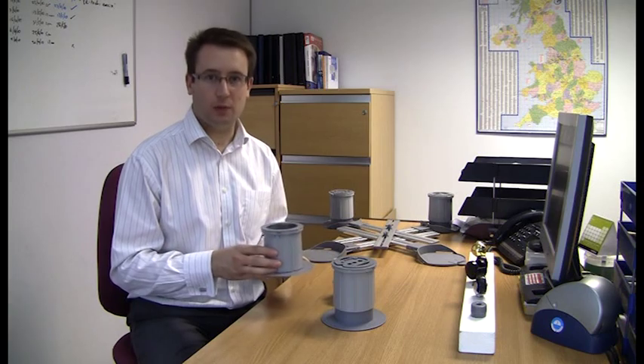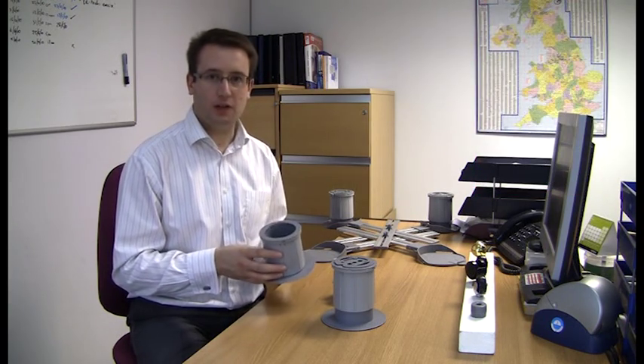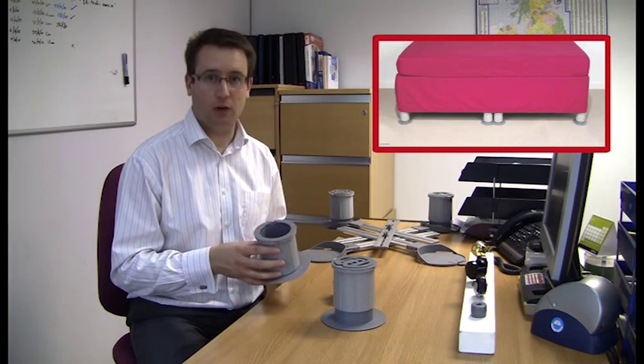The Medici Furniture Raisers have been designed as a versatile furniture raising solution for either pieces of furniture with legs, such as tables, chairs or beds, or for pieces of furniture with casters on, like divan beds or armchairs.